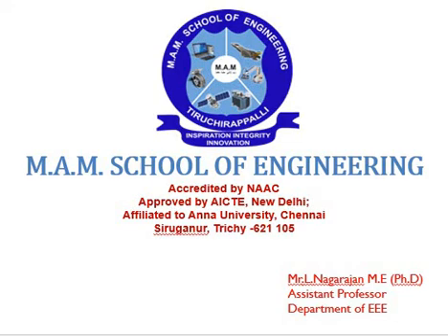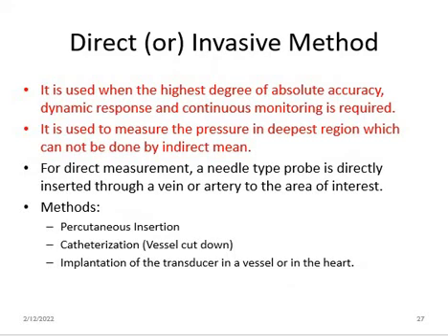Okay, fine. So today, the direct method, or invasion method. Why are we going for this direct method? It is used when the patient needs continuous monitoring, especially in the ICU or for some heart operated patients. These patients will be monitored continuously in ICU, especially the heart performance.